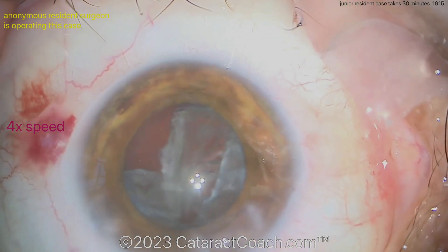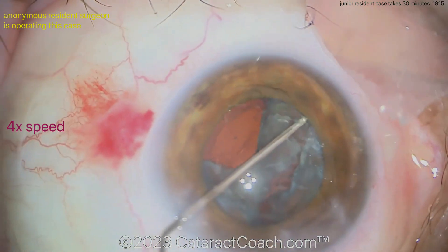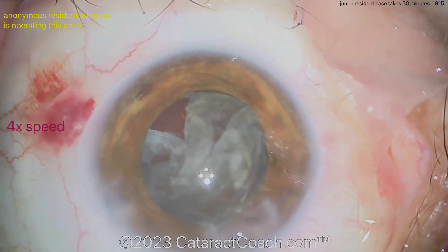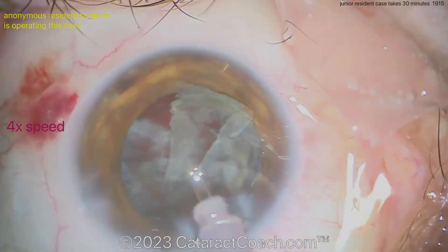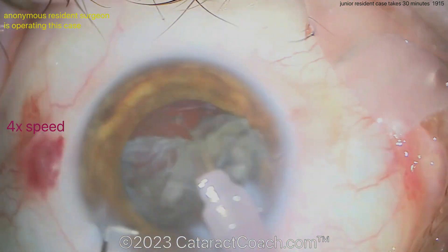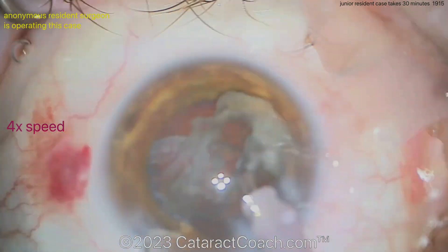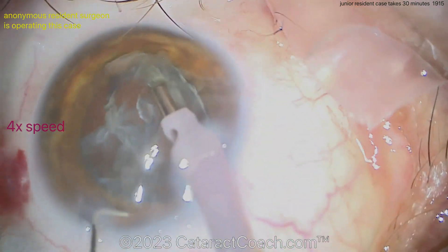One more thing that's driving both of us a little nuts: the top of the screen — all those eyelashes in the field. We don't want eyelashes in the field. Over the last three videos I've posted, you've seen me get all the lashes out of the way. You really want to make sure your draping is done to a more precise level so you don't have lashes in the way. Now, the struggle here is there's a big epinuclear shell — the denser endonucleus has been removed.